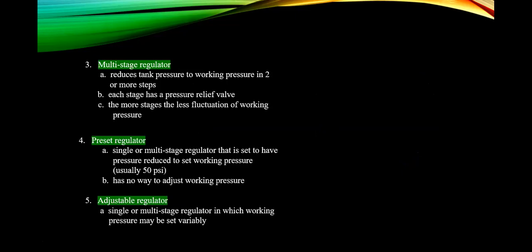All right, so we just talked about the multi-stage and the single stage. Just remember that it counts the reducing valves. Okay, count the reducing valves. Now, a preset regulator is a single or multi-stage that has to be set, okay? Usually they set it at 50. Sometimes you set it at other things. It just depends on what they need at the hospital. If it's able to do more than one working pressure, then it's considered to be adjustable, okay? I don't know why they would need more than 50, and I've never seen an adjustable, but evidently there are some.